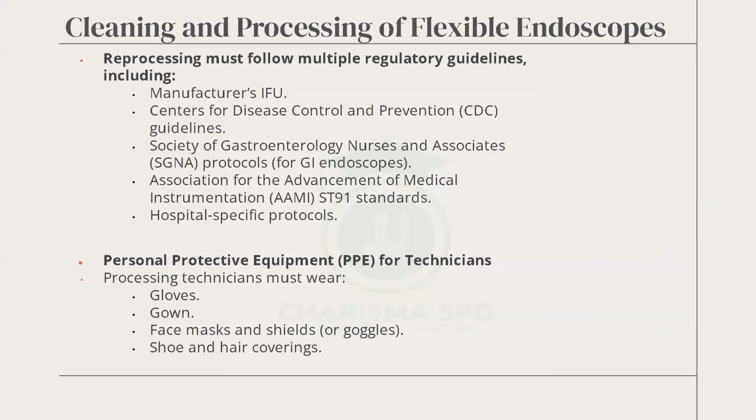Cleaning of this. Some professional bodies, the manufacturer will give their way of cleaning it: using the appropriate brush, the right detergent, the right chemical, and the time of soaking, to tell you how many minutes you have to soak it before you start manually treating it.